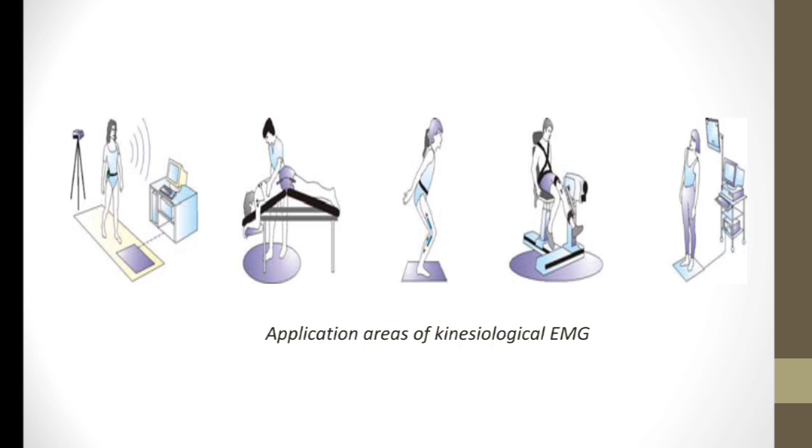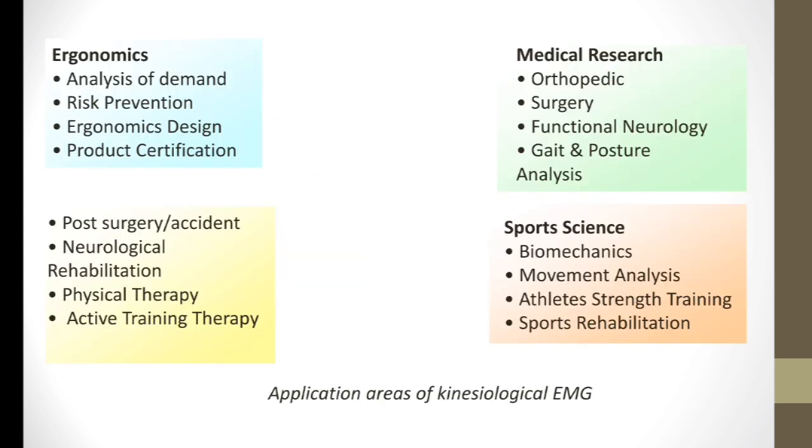Now these are the application areas of kinesiological EMG. Application areas like ergonomics, for analysis of demand, risk prevention, ergonomic design, product certification, post-surgery, neurological rehabilitation, active training, and in medical research for surgery, orthopedics, functional neurology, gait and posture analysis, and in sports sciences for biomechanical analysis, movement analysis, athlete strength training, and sports rehabilitation.